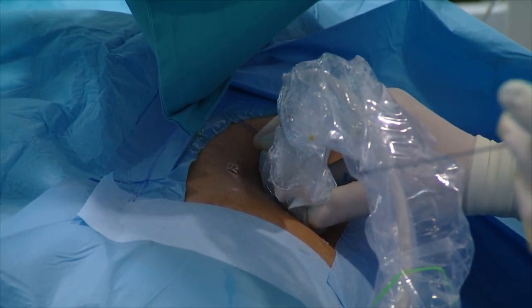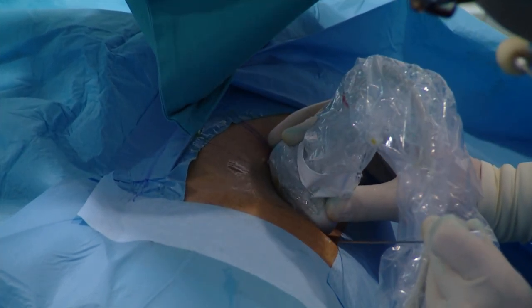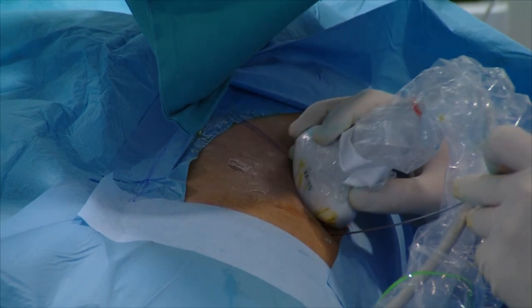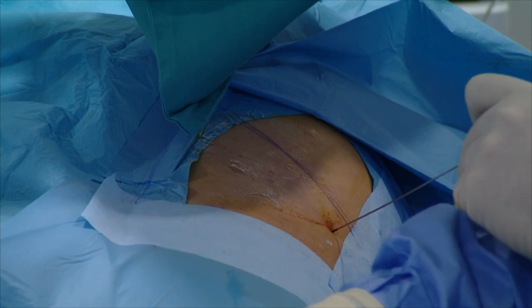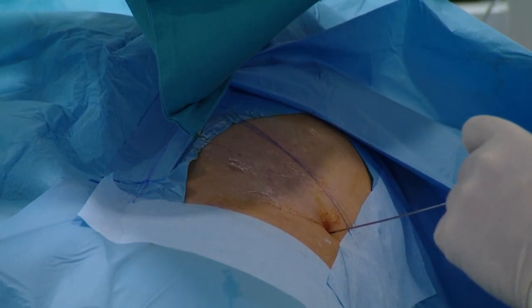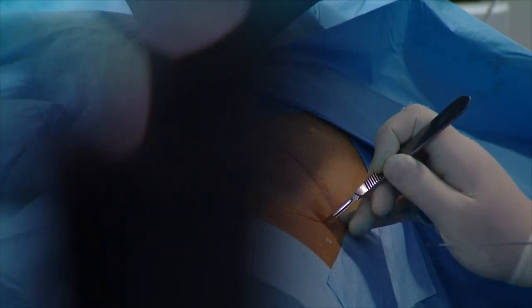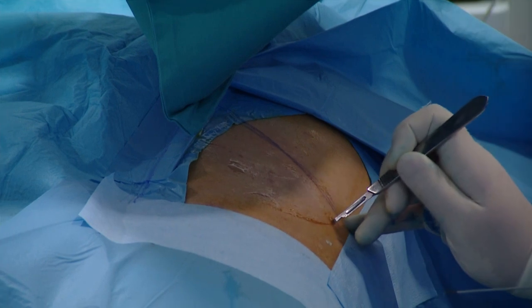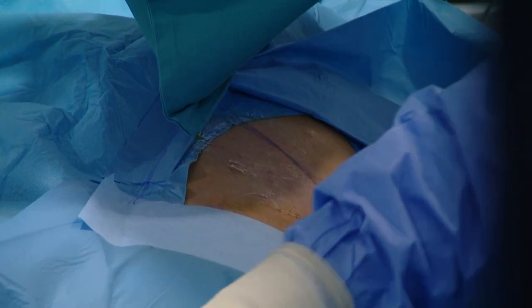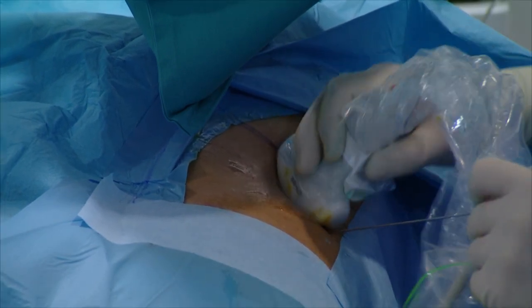Okay. This one is concentrated. Now we take the needle and we know exactly that this is the best area where we can pass the skin. I remove the ultrasound probe and get a scalpel. Without X-ray, this is only the approximately best position of my puncture. This is 5 millimeter. And now I reposition my ultrasound probe and insert the needle.